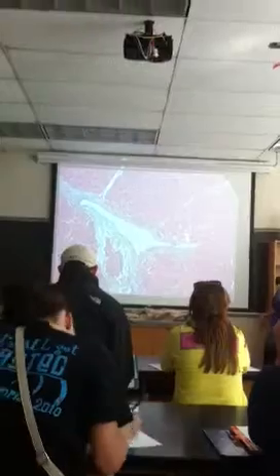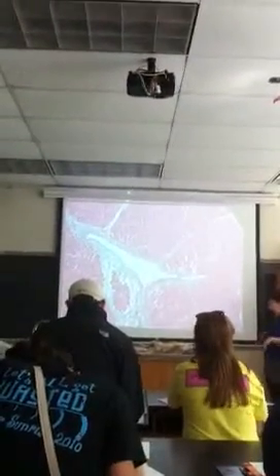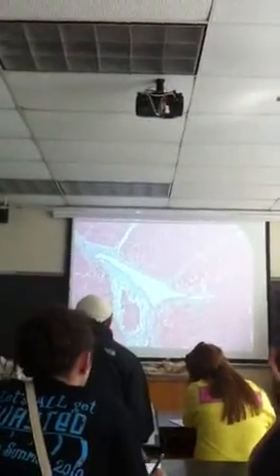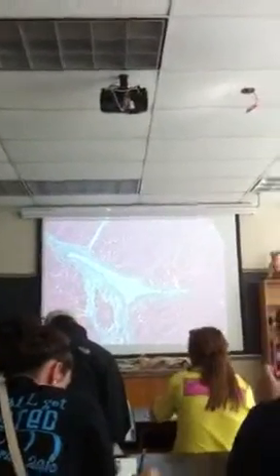Okay, so central vein is going to be large, thin, smooth muscle wall, irregularly shaped, but what sets it apart from a triad venule is that it's not associated with a bile duct or an arteriole. All right? So those are the parts we have on the liver.